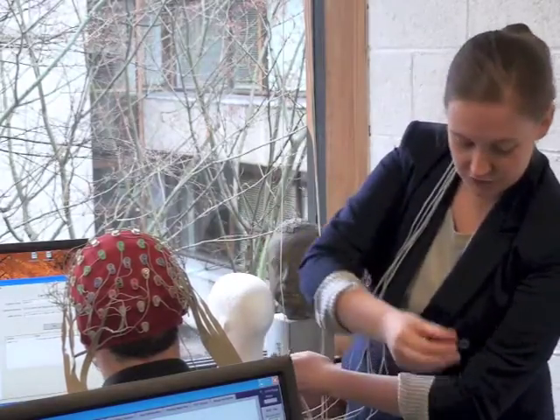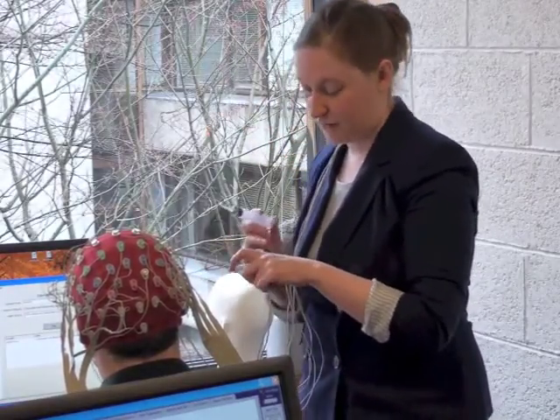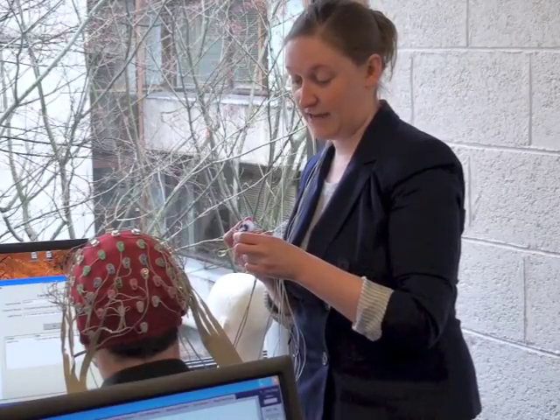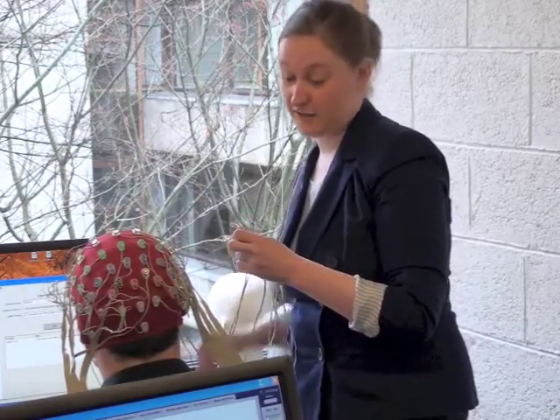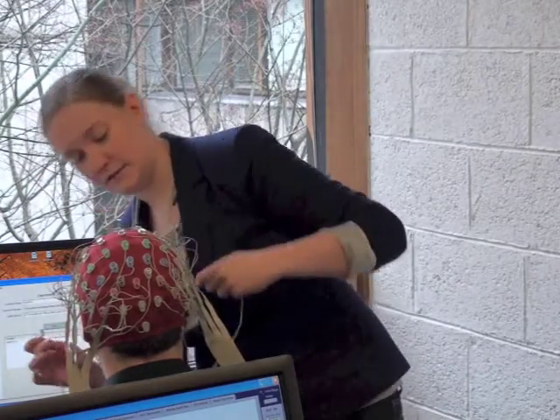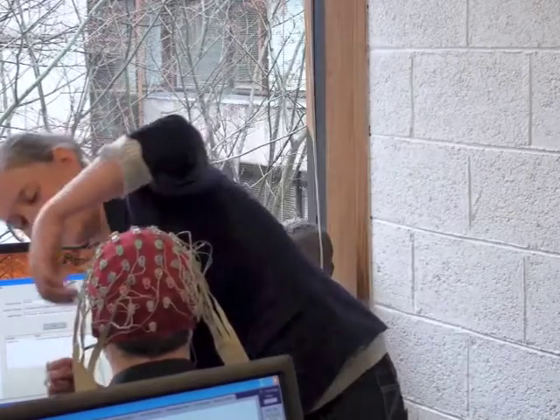Brendan, do you have the other 2 for your other experiment? I think they're in a bag. I don't really need them, it's just to show people. I'll just do the first 4. There's supposed to be 8 altogether. I'll do the 6, and where you put the other 2 is written on the wall there.